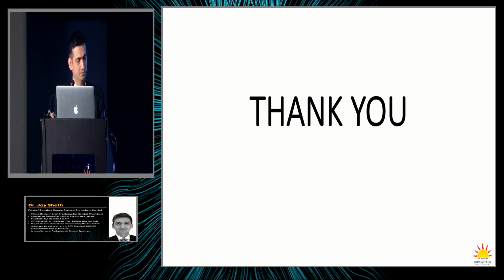I think one of the things that you talked about was projection artifact removal. I think it works very well, except when you're quantifying it for research. I think it takes out some information. So if you're quantifying, you have to be careful when you're doing projection artifact removal.